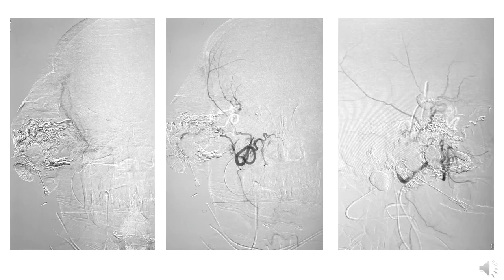On the left is another micro injection. There may be different appearances. Some may be very sharp vessels, some may have this fuzzy kind of appearance, but they all depend upon the size of the vessels. So we keep on microcatheterizing the appropriate target, and we keep embolizing with PVA particles. Usually I go with 100 or 200 micron size.